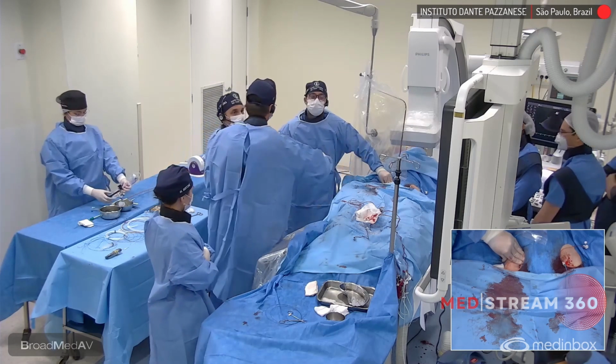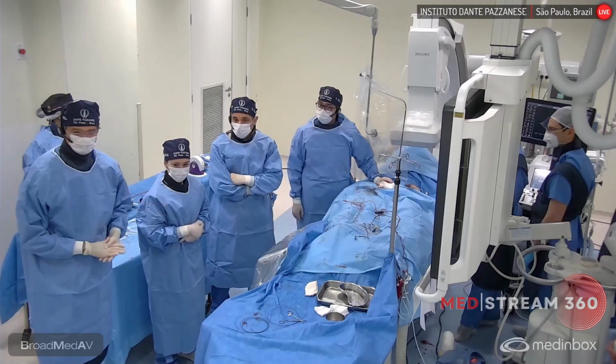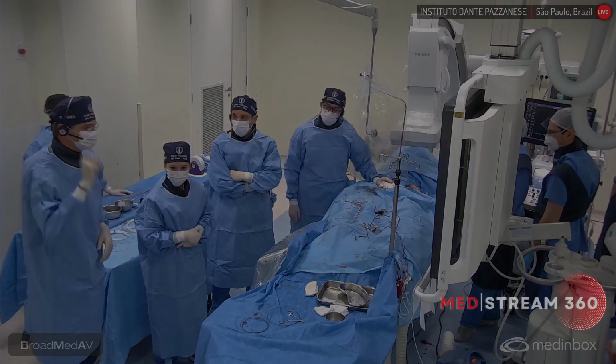So if you go with a covered stent, you do it through the contralateral. Yeah, we go through the contralateral. And you did a great procedure. So thank you. Thanks for the opportunity.